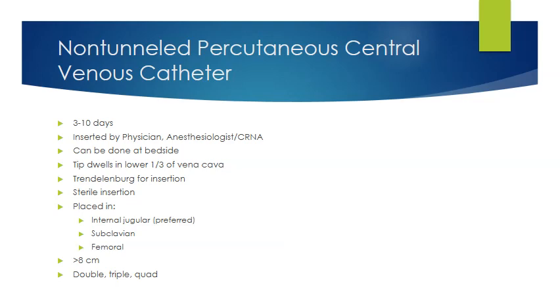Okay, I hope that you paused this and you thought about this and you just didn't wait for the answer. And I'm hoping that what you thought about is this. When we have a patient in Trendelenburg position, the position is what? Head down, feet up. So if I'm going to insert this big bore needle into a person's neck, first of all, why are they going to need this?